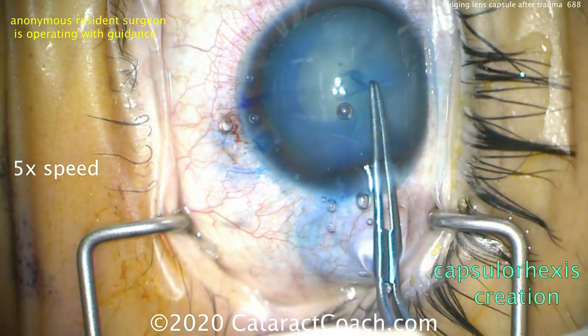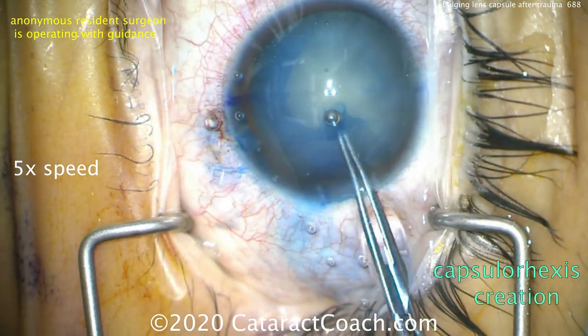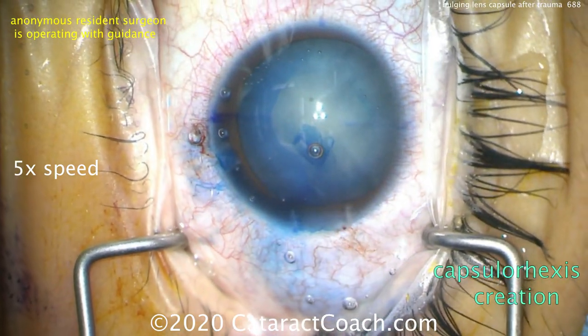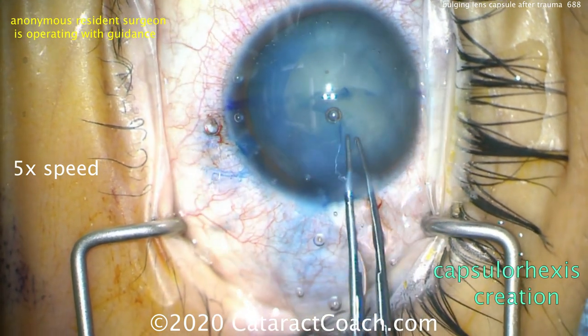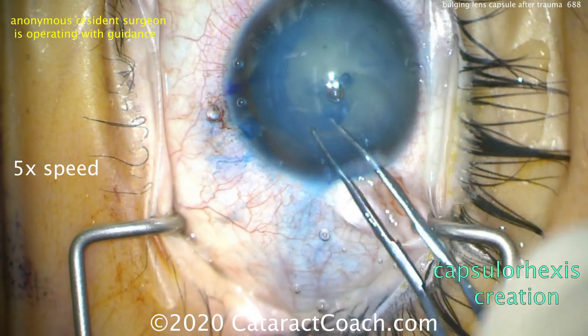This young patient has bilateral white cataracts, presumably from a traumatic bilateral airbag injury after a car accident. Fortunately, the rest of the eye exam is normal, including the zonular support of the lens.